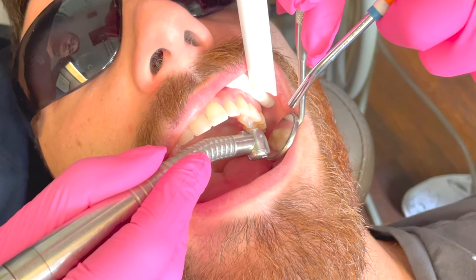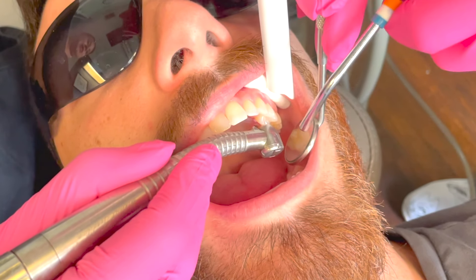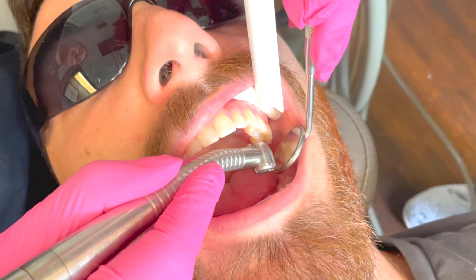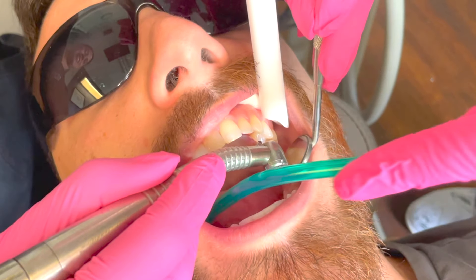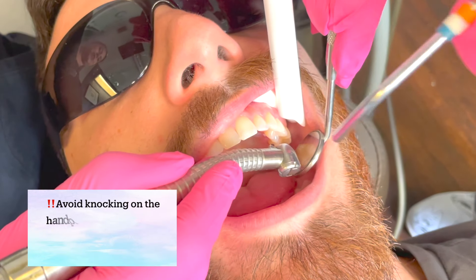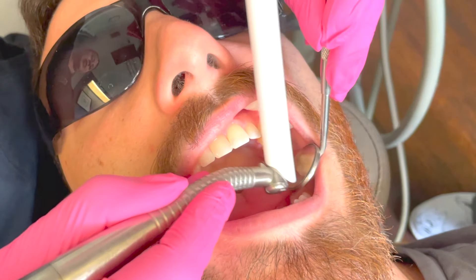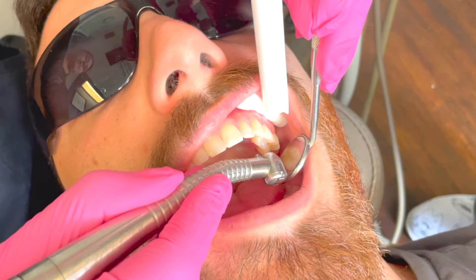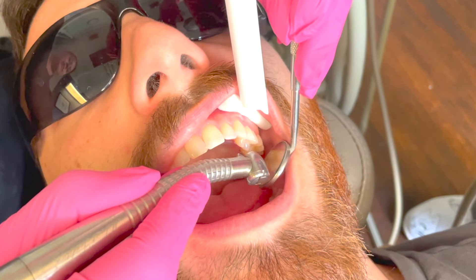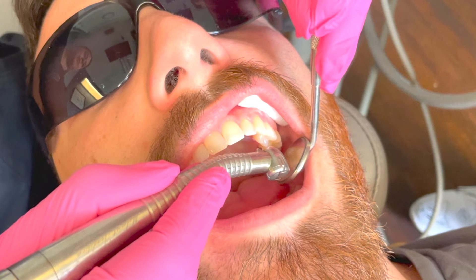You're suctioning from this angle, but there is definitely going to be some water back there. You really have to multitask — it's fast. If you see there's a puddle, you let go for a second, come in, suction, and get out. Gabby did not move the handpiece while she was sneaking in the saliva ejector — you really want to stay firm so your suction doesn't move. The worst thing that can happen is for your suction to bump into the handpiece and the doctor ends up cutting another tooth.